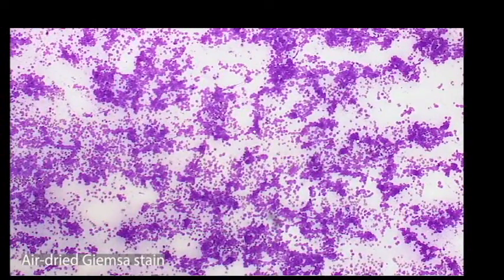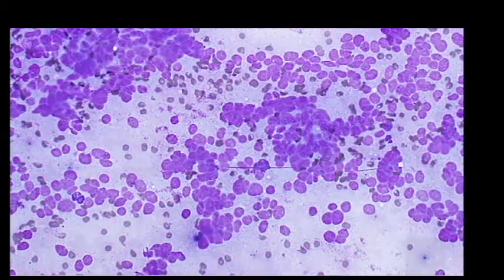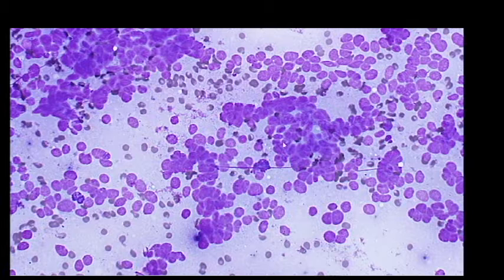Very busy, lots of nuclei present, and they're sort of dispersed, but also in messy clumps that are really quite kind of tight. Doesn't seem to be a lot of cytoplasm. High power confirms that. You can see really tightly moulded little groups of cells, nuclei that is, some elongate-ish ones as well as round and things in between.